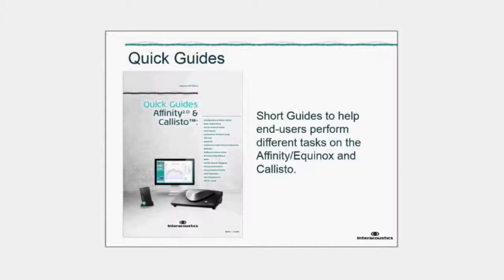Although these are unchanged, I wish to promote them again. We really like our quick guides, and we find that they're really good short guides to help new users quickly learn and perform different features with our systems. We really encourage that you translate these into your own languages as well, because they really do help the user if they have come from a previous system, and it also helps to reduce the learning curve.